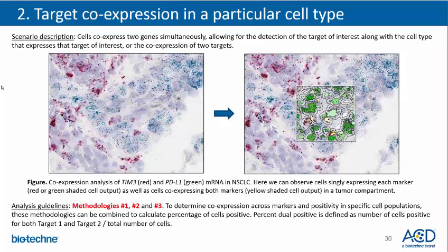The data could be presented as the cells individually expressing TIM3 and PD-L1, or as the total number of cells co-expressing TIM3 and PD-L1, or the number of TIM3 expressing cells that also co-express PD-L1, or reversely, the number of PD-L1 expressing cells that also co-express TIM3.